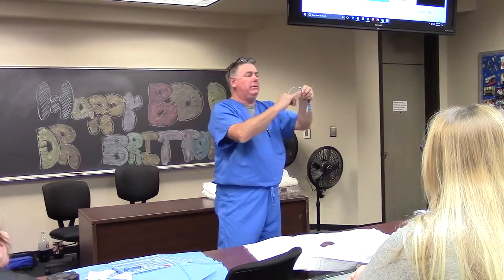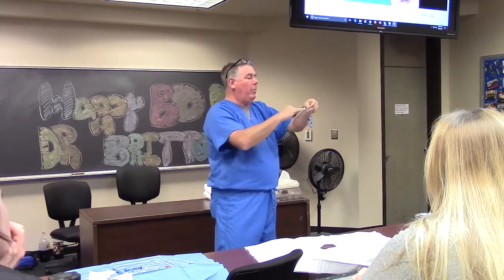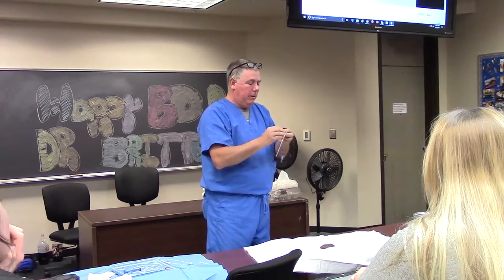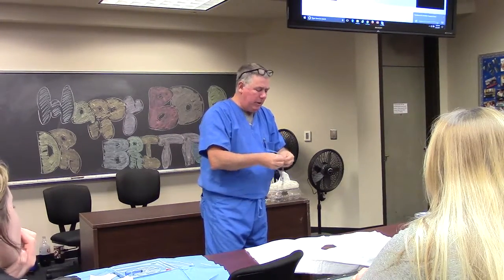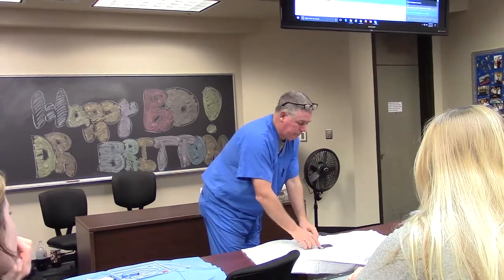You see, this has wings on it that you can suture down. If you don't put it all the way into the hub, and you probably shouldn't, this little device here, you compress the wings and it opens up a channel. And then you put this over the thing like that. And that's in the case.